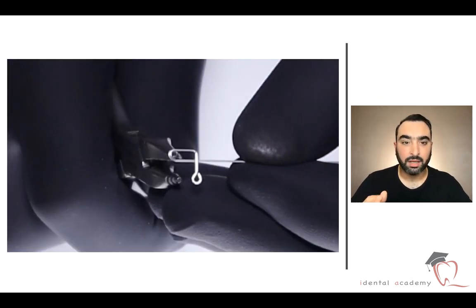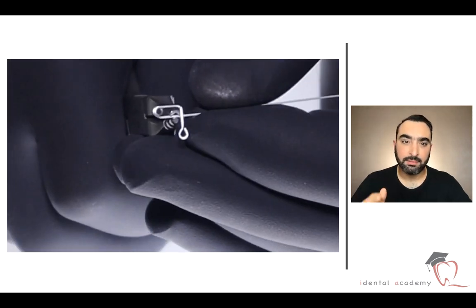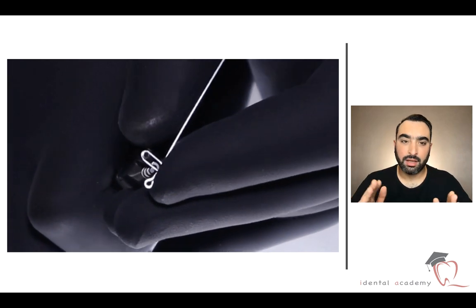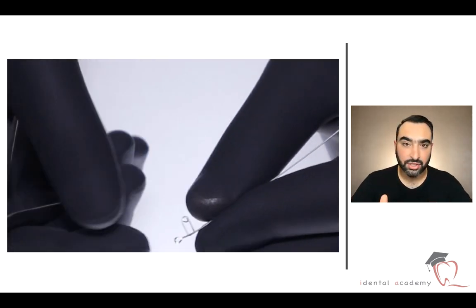After we finish this part, you can be sure that everything is okay. Now make the last bend to put the wire on the same plane of the main wire. Now this part is finished.